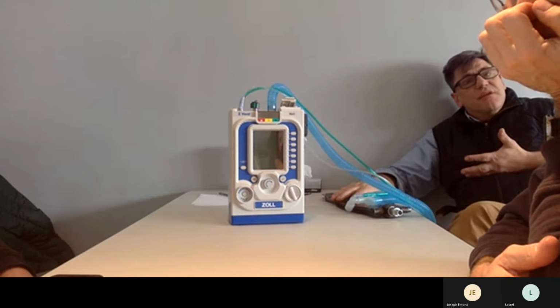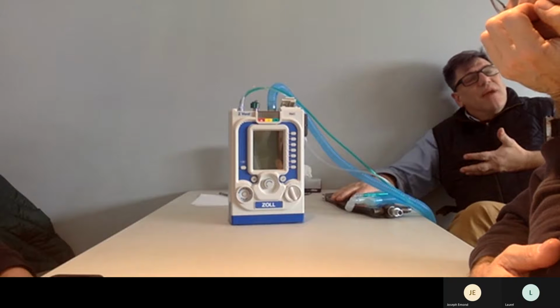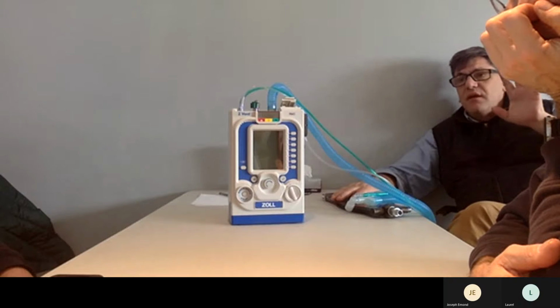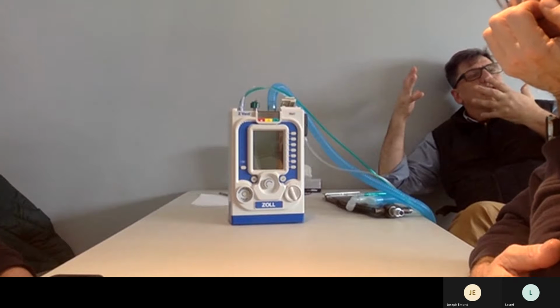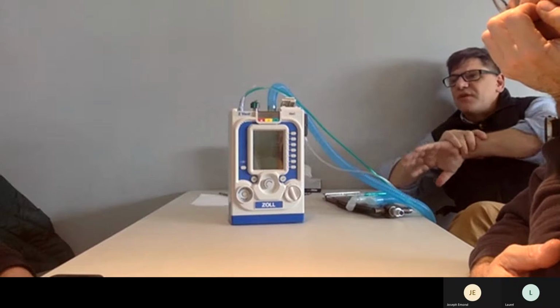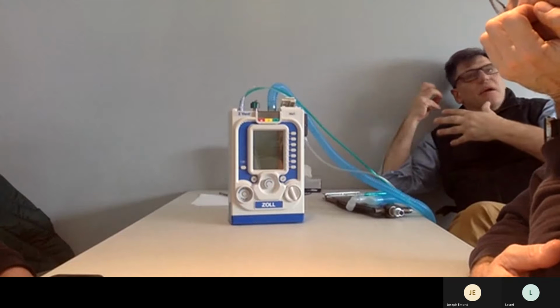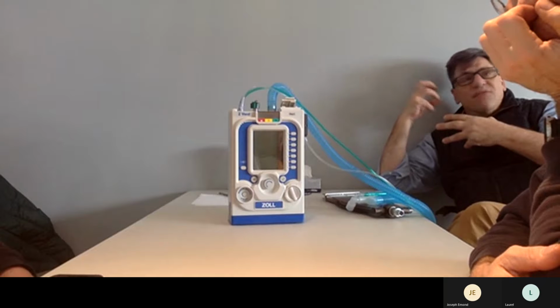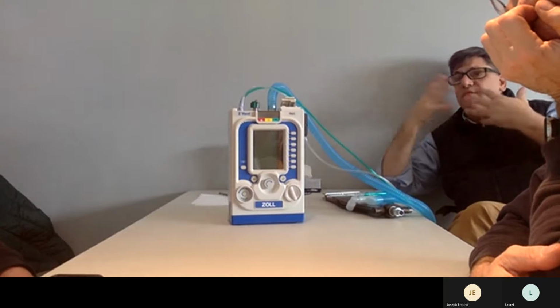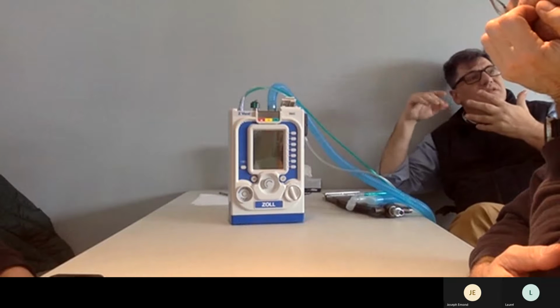There are a few people in the room who remember the time before continuous positive pressure. When we had these failure patients, we would sit them at 90 degrees, reach over them, and use a bag valve mask on their face. When they squeezed my arm, I'd squeeze the bag. I had intermittent positive air pressure. The disadvantage is that each time I release, I lose all my PEEP and all my treatment, and then I catch it again, up and down, chasing my tail.